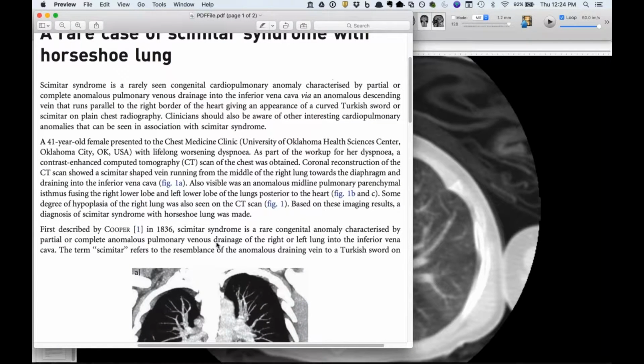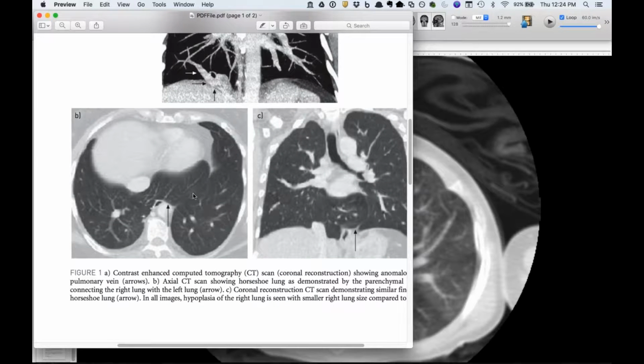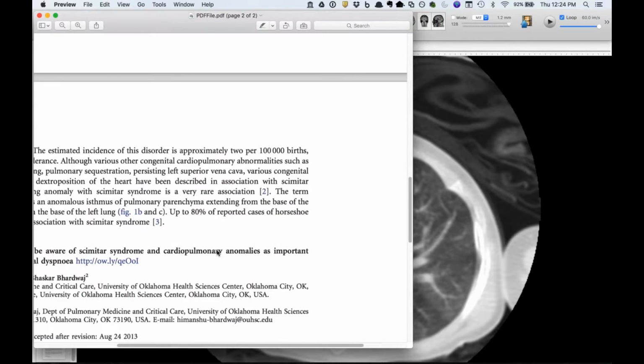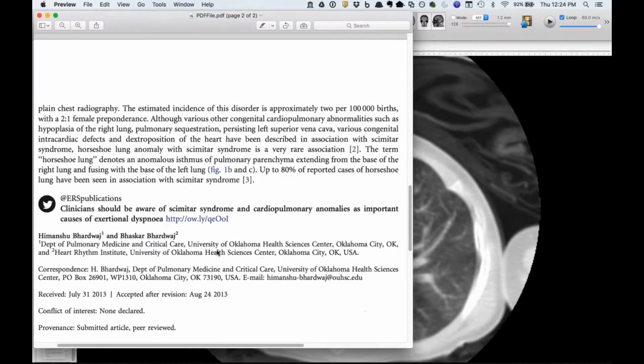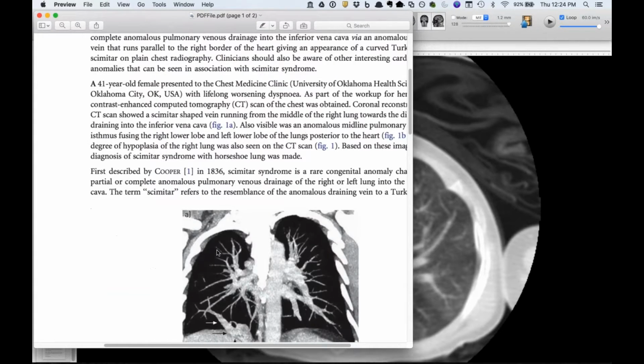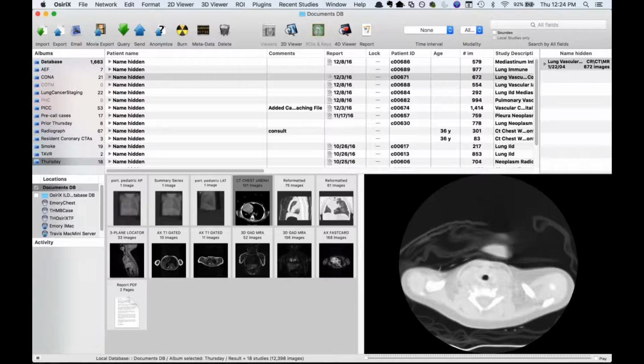This was just a case I found. I think it's from the Blue Journal a couple years ago, but you can see here, this looks very similar. This is in an adult, but again, they're calling this a horseshoe lung, but there's not really that true fusion. True. So I like your term pseudo horseshoe. I guess this is one of the European respiratory journals, but that was one, and then I had another one too. That's the two of them, both in young kids that had imaging here.